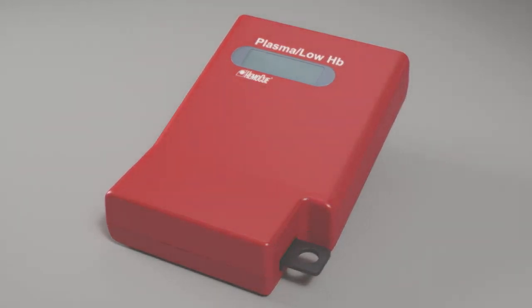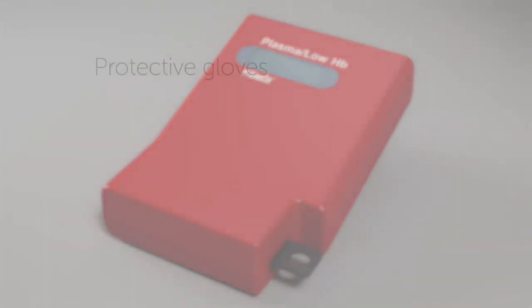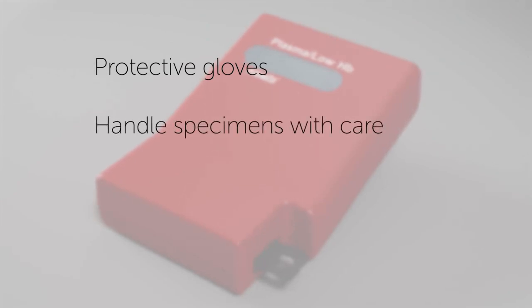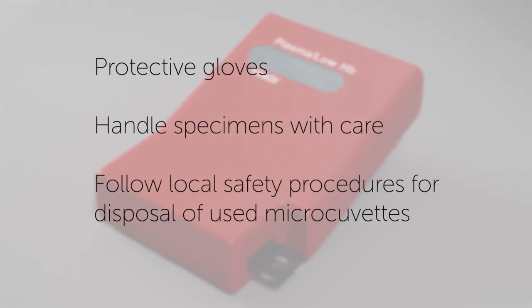For your own safety, please remember to wear protective gloves, handle specimens with care, and follow local safety procedures for disposal of used micro-cuvettes. For more information, please visit HemoQ.com.